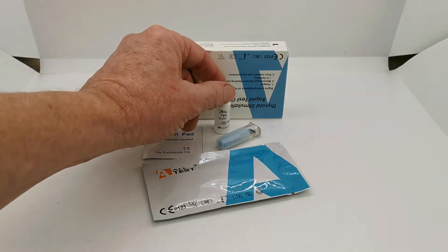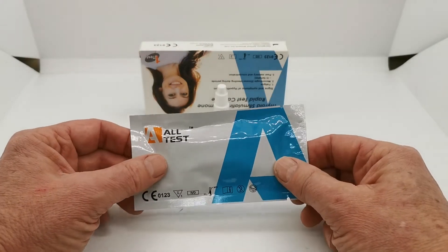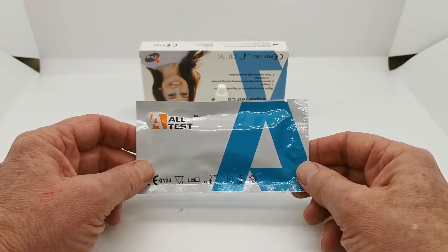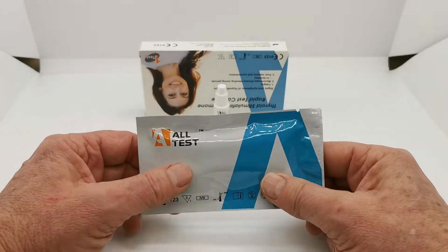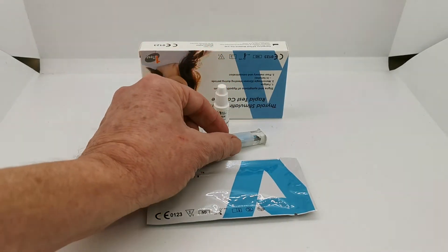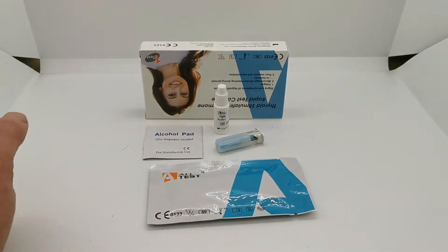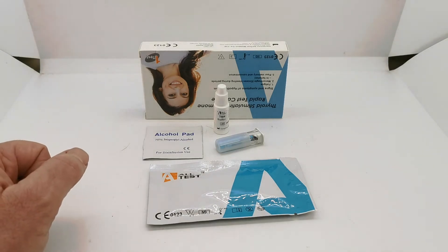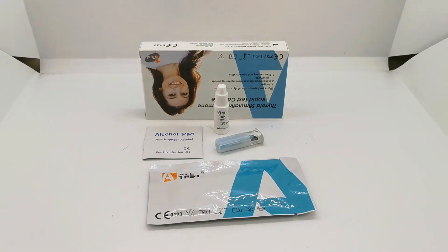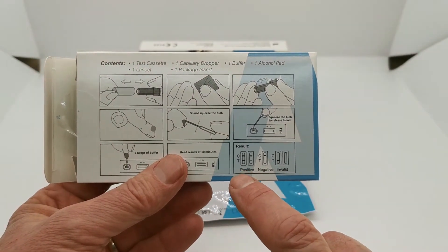There's also a buffer solution which is necessary to add whole blood into the test cassette, and packed in foil is a single use test cassette with a control line, test line, and a sample well, along with a pipette which is used once you've done the finger prick with the lancing device to transfer droplets of blood into the test cassette well. Then two drops of buffer are added and the test runs itself, with results read at 10 minutes.